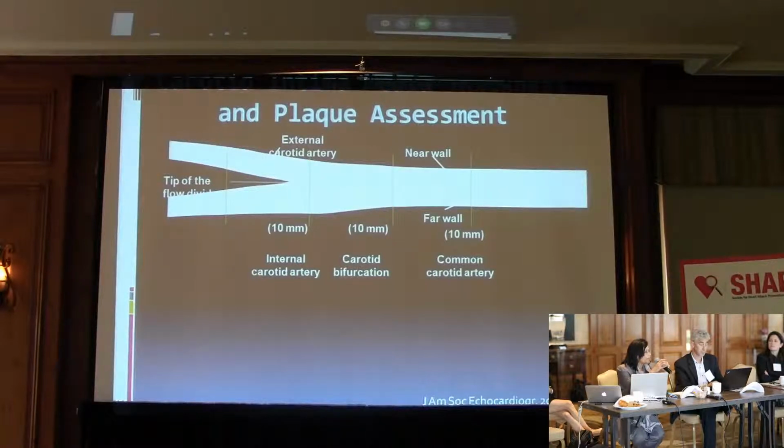And that is a fundamental way of looking at it, that one should look at the literature behind CIMT and why CIMT has been less robust than coronary calcium scanning in risk prediction and risk stratification. And what we need to do to go beyond that. So here is the intima-media layer that we measure.